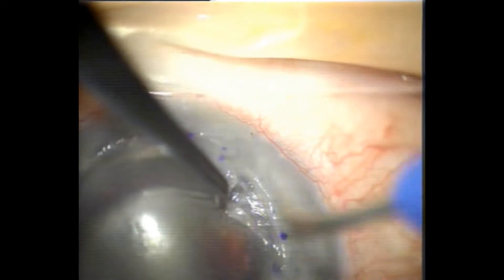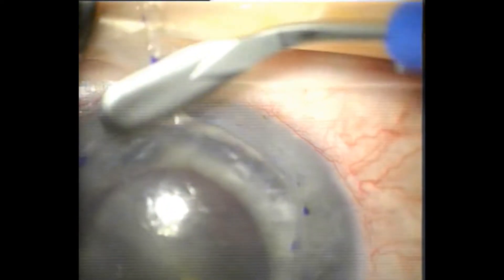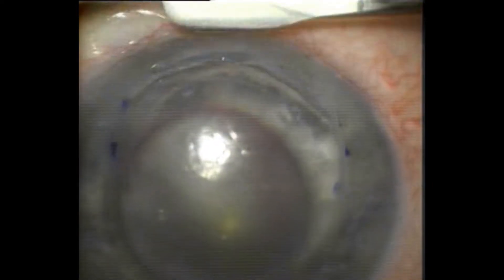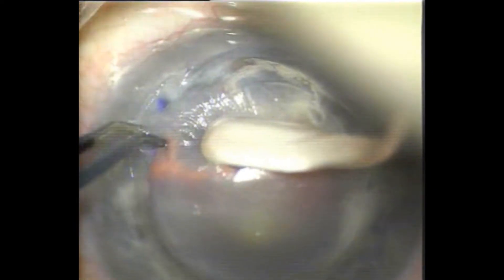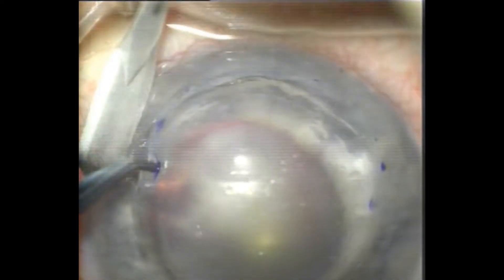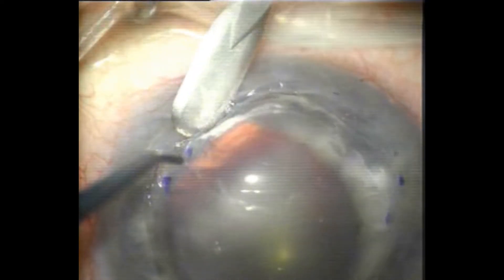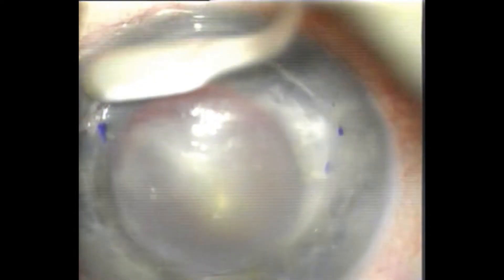You can see I have a reasonable thickness of cornea in the periphery there to suture into. I've just opened the AC inadvertently. Just stripping out that ectatic tissue now, and going to the other end and just starting the separation there — making sure we have a reasonable depth — and just stripping it out, pulling it out.